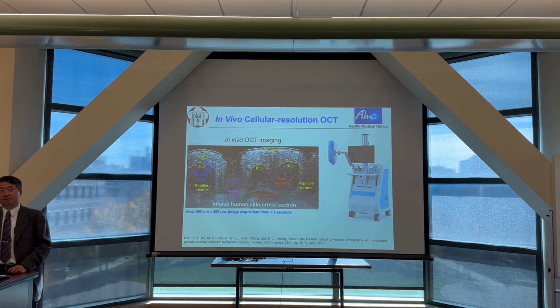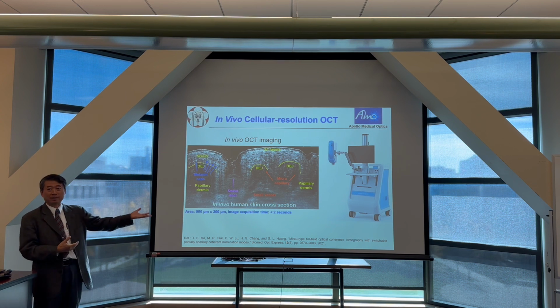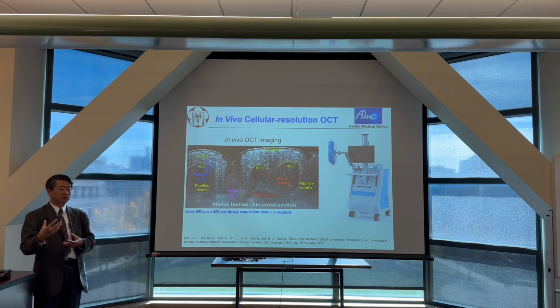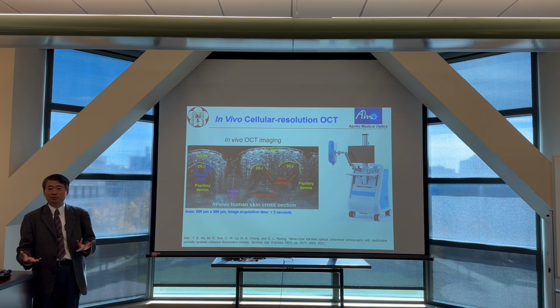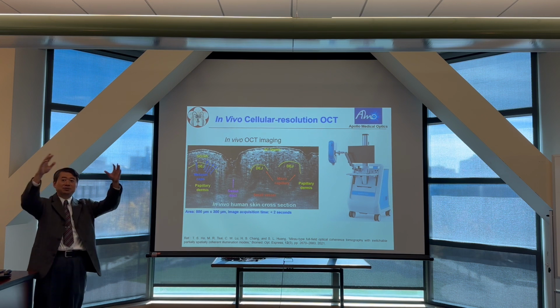Even with 2,000 patients and a good result, it doesn't mean hospitals will use it, because these days you need insurance reimbursement. You start with a system approved by the FDA, then a small clinical trial, so you can get what's called a CPT code, because to get reimbursement you have to have a code. Once you have a code, it doesn't mean the insurance company will reimburse. You've got to have a large clinical trial.